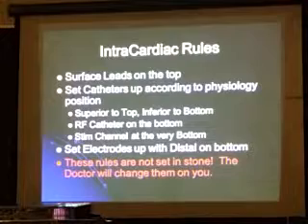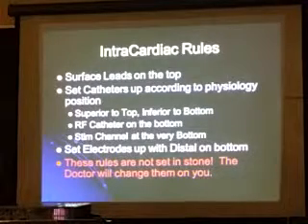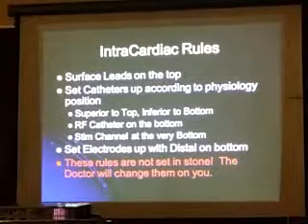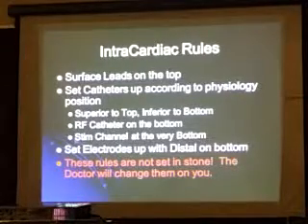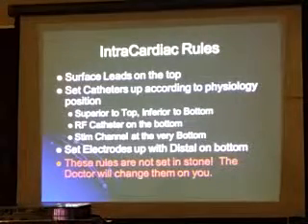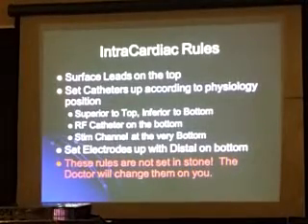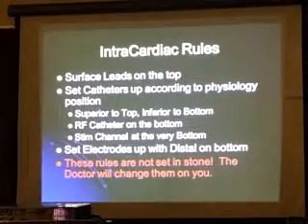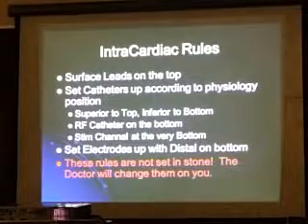Like I said, these rules are not set in stone. I used to have a statement from my paramedic, EP, cath lab, concert, ER days: no plan ever survives first contact with the enemy, the patient, the doctor, the band, the venue. Everything will change based on whatever. There are many times I go in and they want me to help them build a study configuration. I'm like, where's the doctor? Because I know he's going to have his own rules. Oh, he says he'll be here 15 minutes before the case starts tomorrow. All right, so we're just going to build it the way traditionally it's supposed to be built. And then when he comes in, he spends 30 minutes complaining because it's not the way he likes it and he can't figure out what's going on.